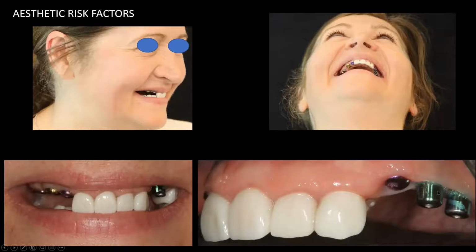That's not the issue. What the treating dentist failed to do was explain that we expect a vertical defect. We expect prosthetic gum replacement, because vertical bone augmentation is very unpredictable. Stan, please comment. This one worries me a lot.